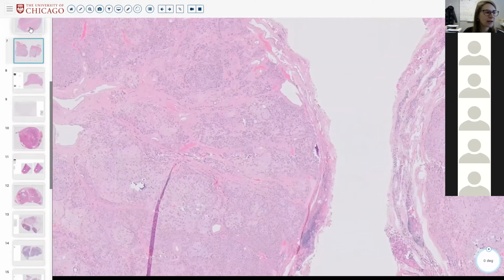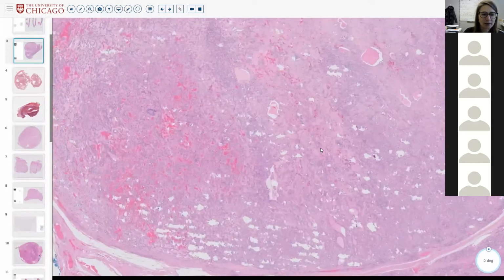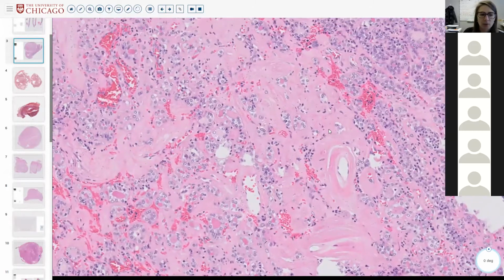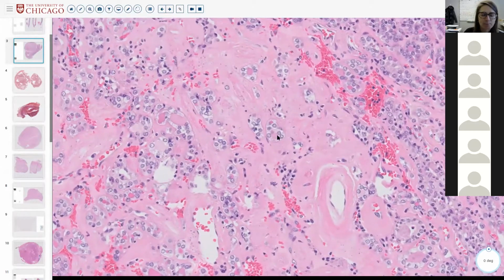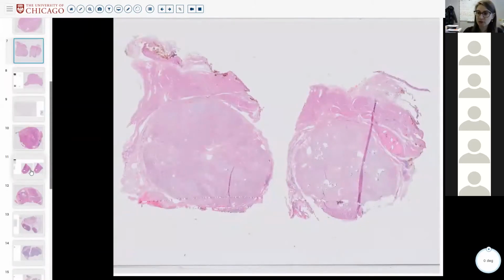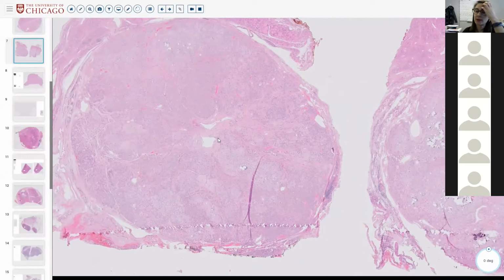Remember, you can have stromal expansion between the follicles in some cases, but the other patterns of the follicular cells don't match the concept of hyalinizing trabecular tumor, right? You can get stromal material in other tumors, but to make the diagnosis of hyalinizing trabecular tumor, you have to have all these features. So what is hyalinizing trabecular tumor? Does anybody want to explain what it is and why we separate it out from other neoplasms?